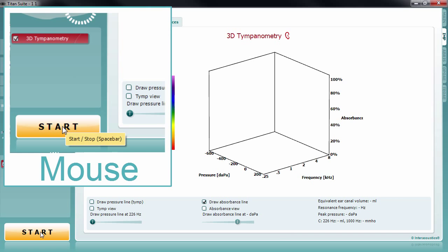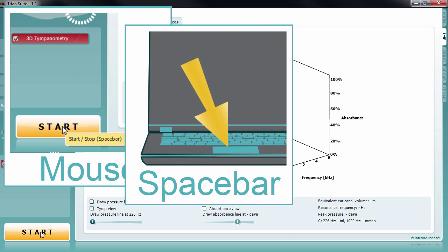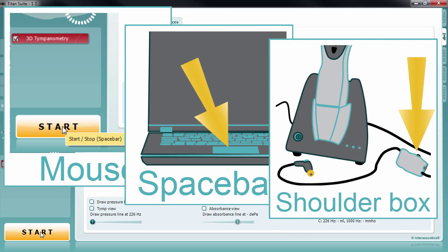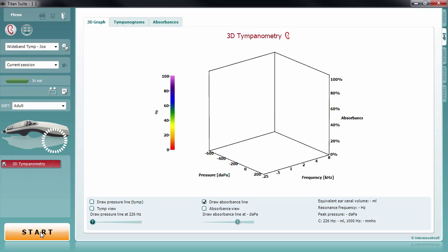Start the measurement by pressing the start button in the software, the space bar, or the shoulder box button. The probe then produces a wideband click at a rate of 21.5 Hz.